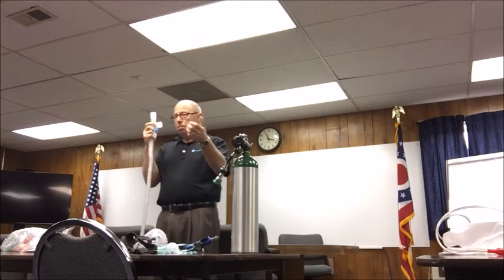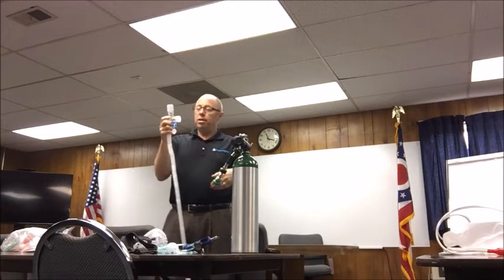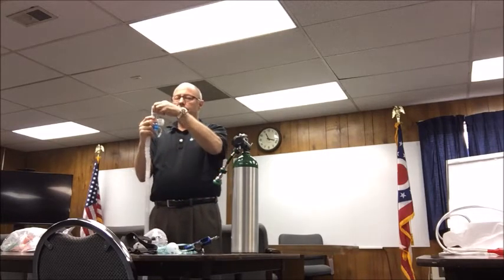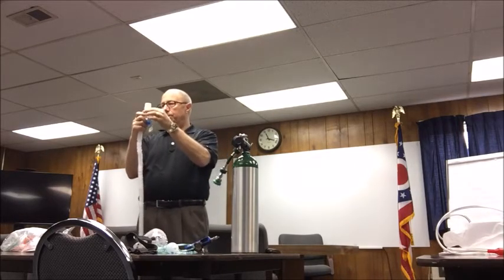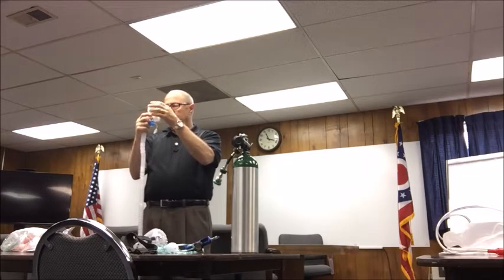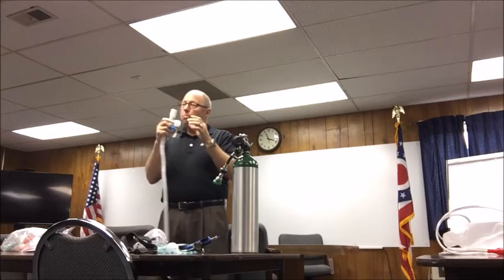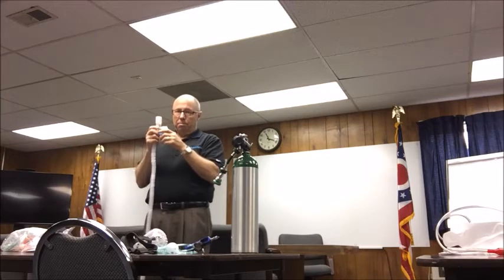Now I know with the immersion, we're used to turning up into the green, yellow, green, whatever. With this, you hold the bottom, just like this, and if I want to go from 5 to 7.5, I just turn it, okay? And there's a little notch there, and you'll feel it. If I'm on that side of 7.5, I'll probably get 7.3. If I'm on this side, I might get 7.6. But you want to be kind of into that notch, and then we can take it all the way up to 10.